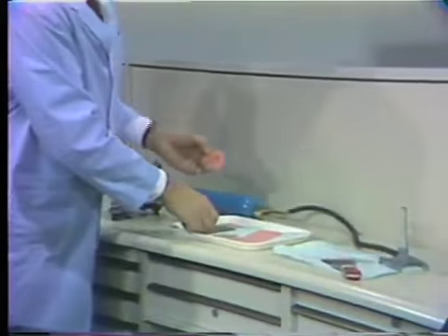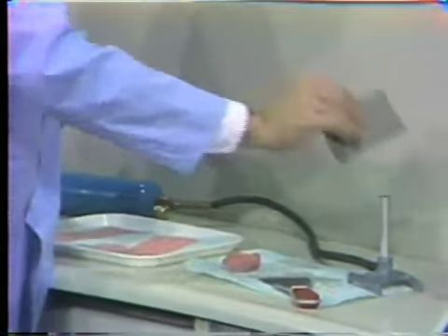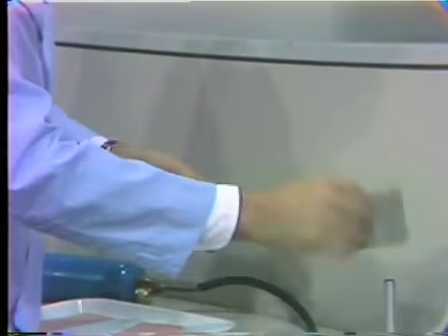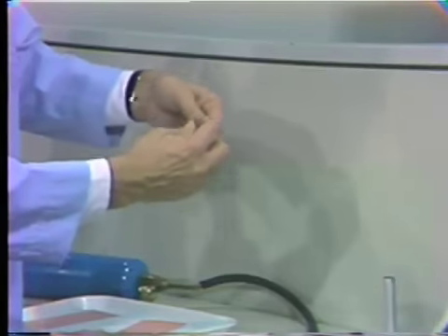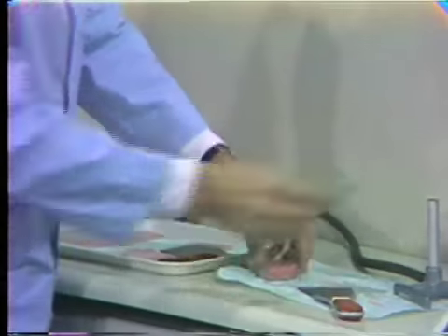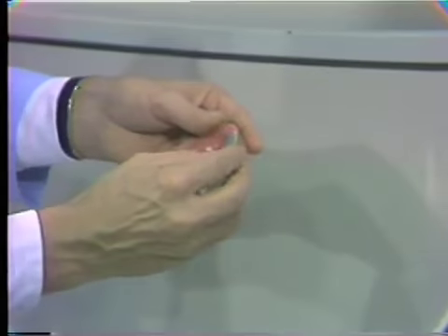For this purpose, there are several waxes that can be used, but we will use an alu wax. And we'll fold it. Remove the excess. And again, soften over the Bunsen and place onto the area where we had removed the pink wax.